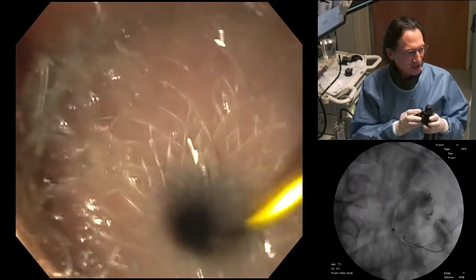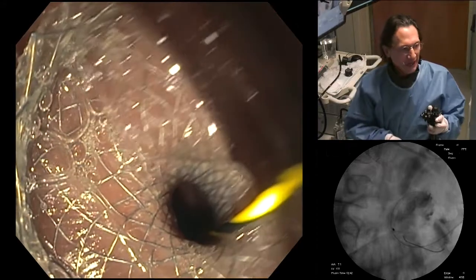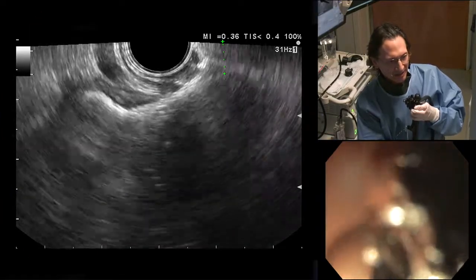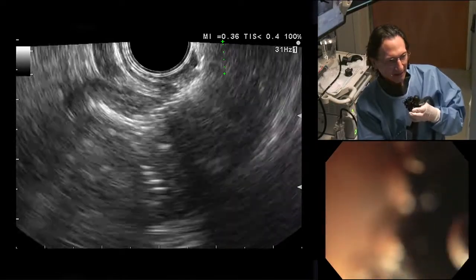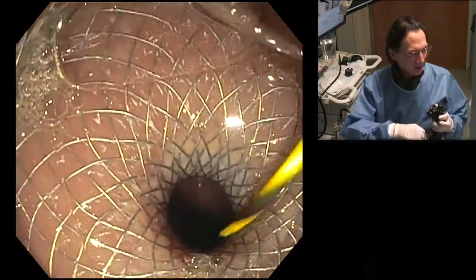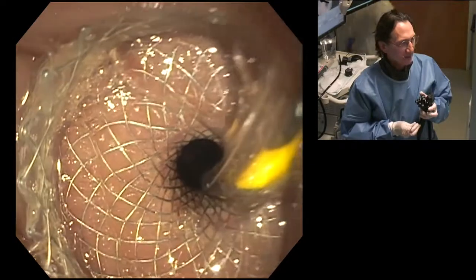And we're leaving the wire just there. I want you to advance the CRE balloon 12 to 15, please, over the guide wire. There's a nice view. Why don't you make the EUS large? You see the AXIOS stent now very nicely in the small intestine. Looks very nice. Watch the wire, please. Going down, we'll just put this in under direct endoscopic visualization. There it is, in great position. Advance it a little bit forward until we see the purple mark. There's the purple mark. Dilate up, please, now.